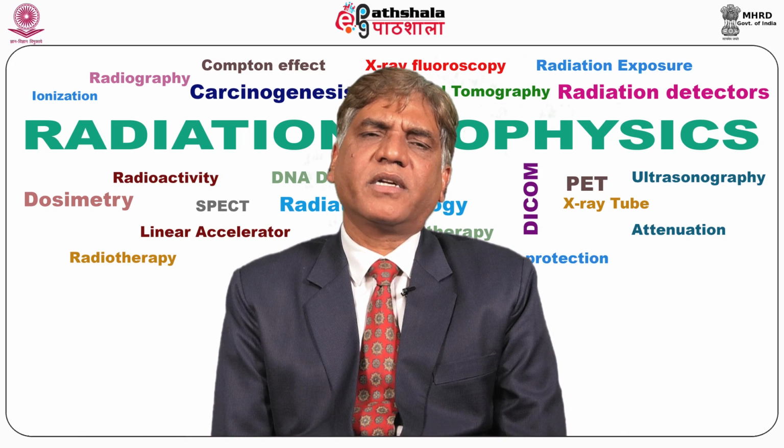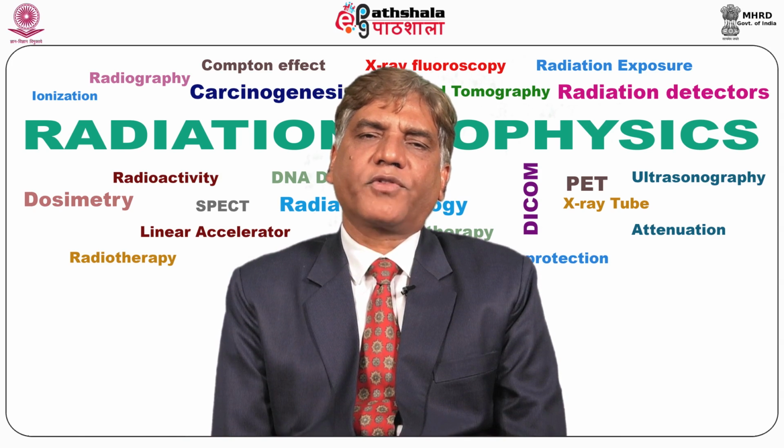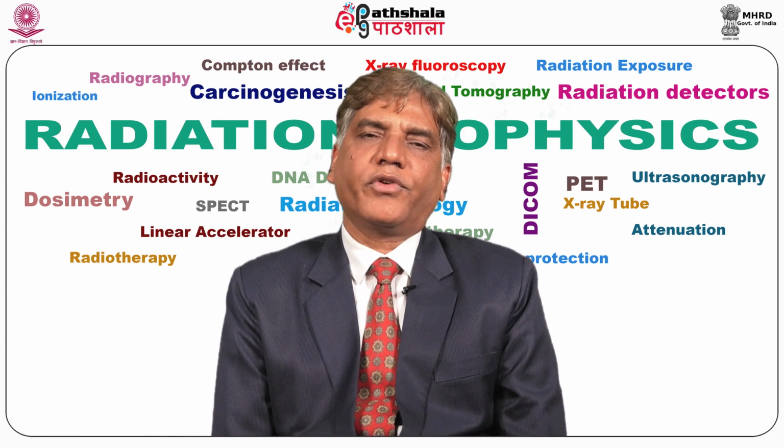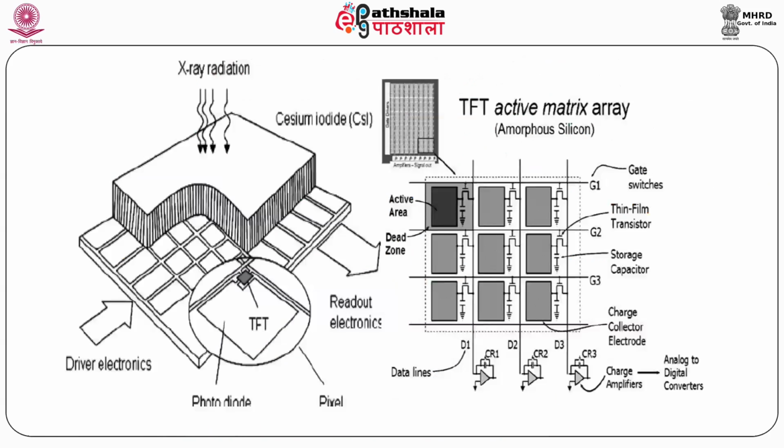Therefore, photodetectors like PMT or CCD arrays are used. A fiber optic light guide plate is placed before the photodetector, which transmits blue light and attenuates the red light emitted by the laser beam. Photodetectors convert light into an electrical signal whose output is in analog form, as you can see here in this figure.